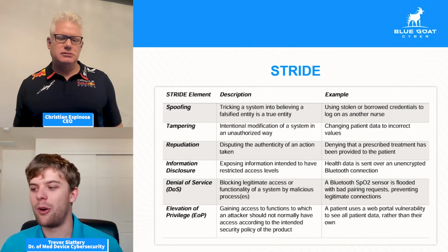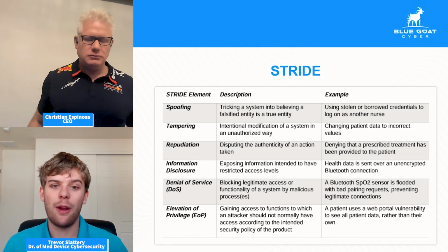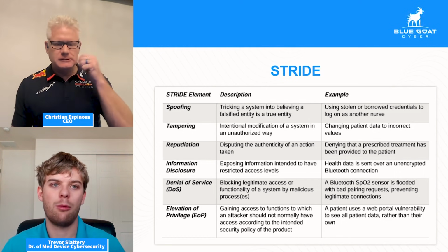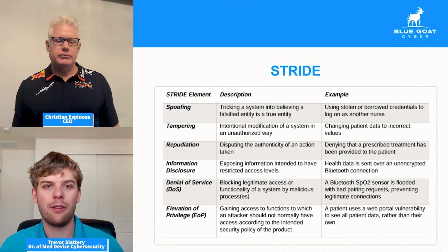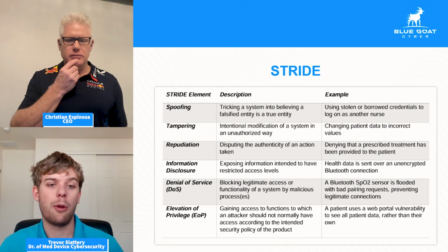And it's especially important with cases like sepsis, where you have such a short amount of time to get accurate treatment. And if you miss that window, you can be in a lot of trouble. So it's really important that life-saving devices especially are kept with really high uptime. They're as close to perfectly reliable as possible, and so there is not much that takes them offline. So identifying a problem that can just cut out the functionality of a device can be a pretty big deal.